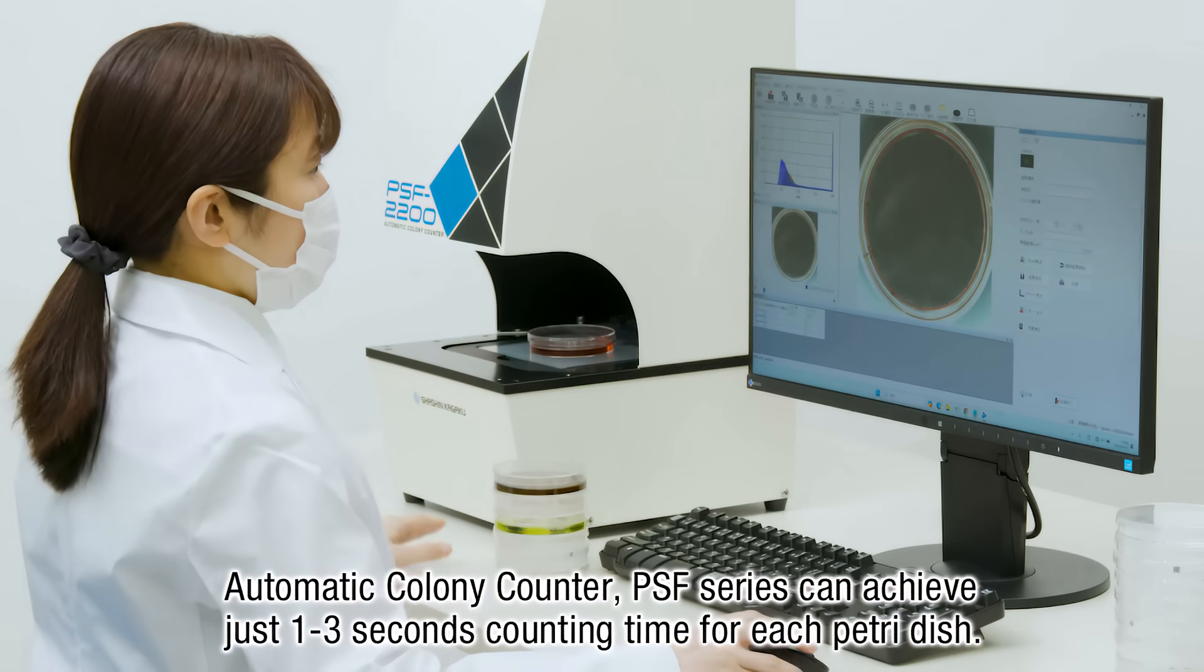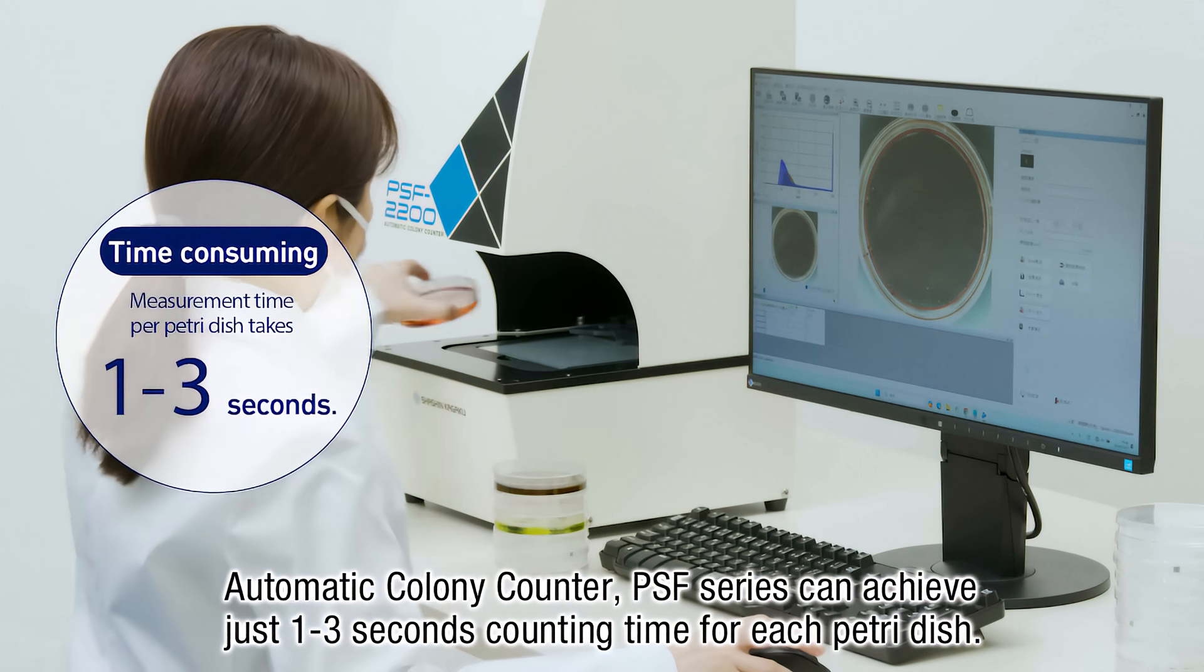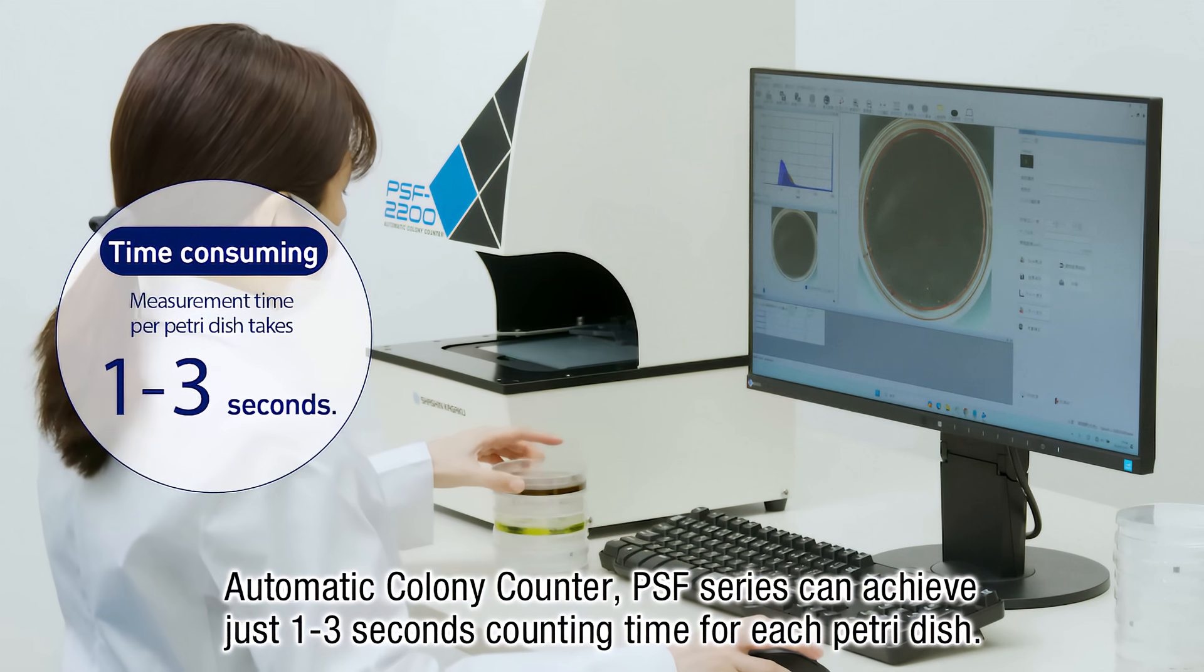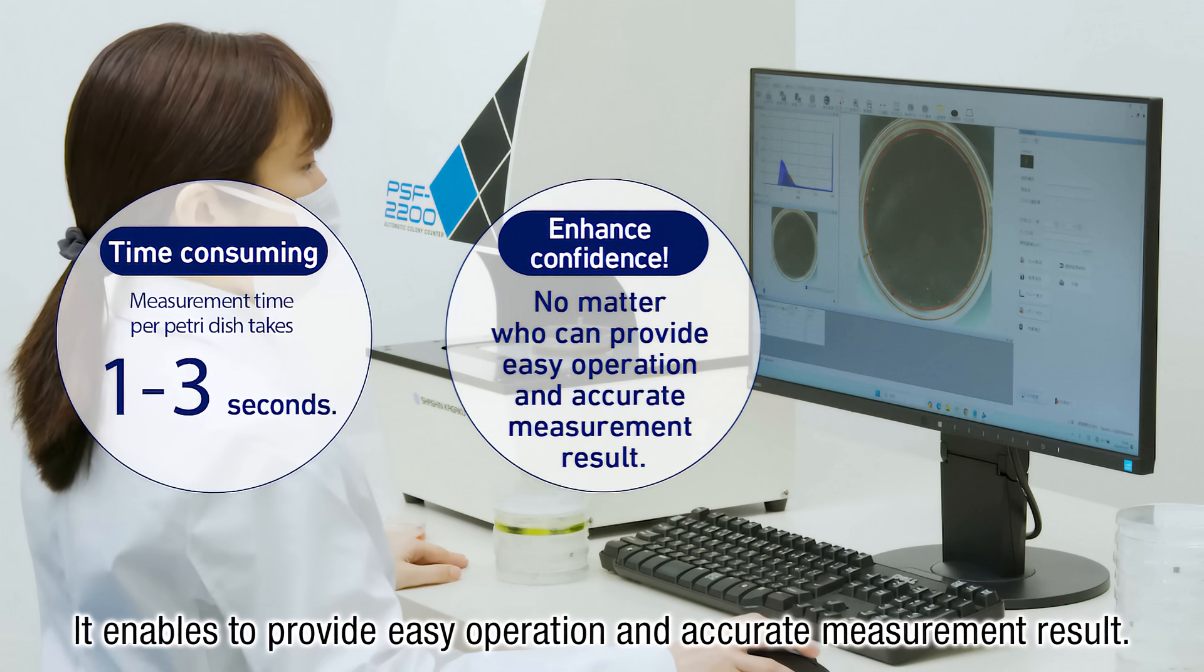Automatic Colony Counter PSF Series can achieve just one to three seconds counting time for each petri dish. It enables easy operation and accurate measurement results.